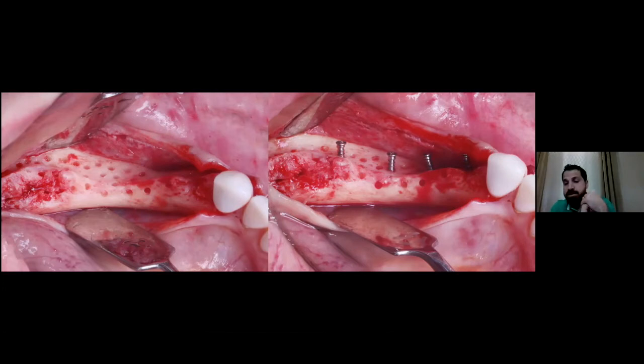Another thing that is important to say is the tension that you're going to have over your bone grafting. The most tension from the flap over the bone grafting is usually at the edges, especially when you have an adjacent tooth like this one. So it is important here to place a tenting screw at this area just to support the most mesial and the most distal part of your GBR. And you're going to see later on in the result where we had most of the resorption.